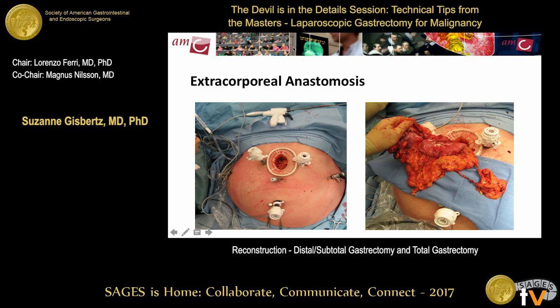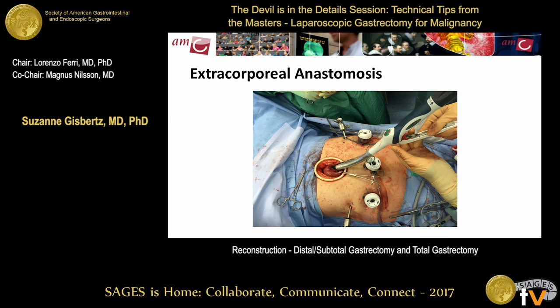Comments on extracorporeal anastomosis: although increasingly doing more intracorporeal work, extracorporeal is still valued — particularly for mid-body tumors, as it allows gross assessment of margins during transection and easy revision of those margins. Through the accessory incision, you can perform a Billroth 2 or Roux-en-Y, and it's very accessible. There's nothing to be ashamed about performing an extracorporeal anastomosis — you don't lose credibility.